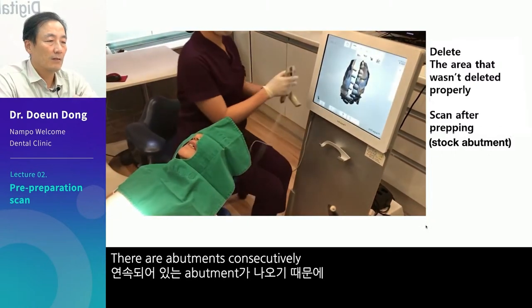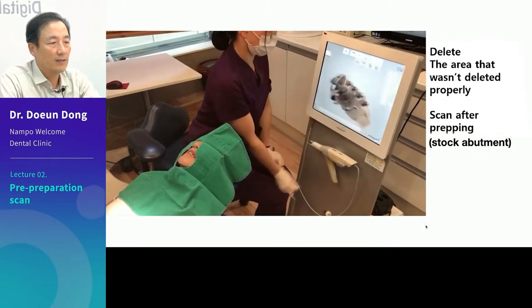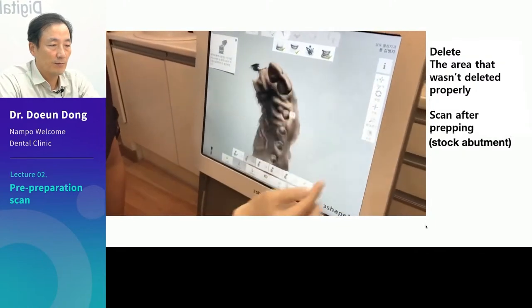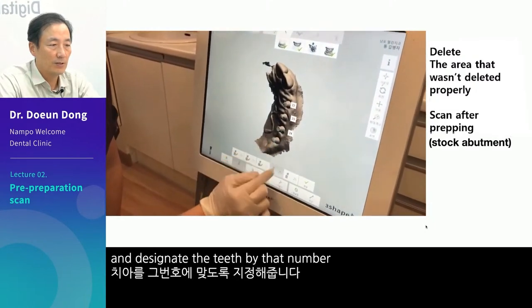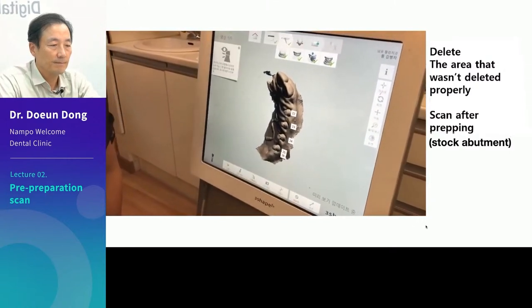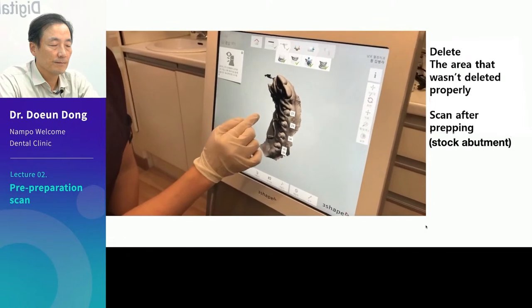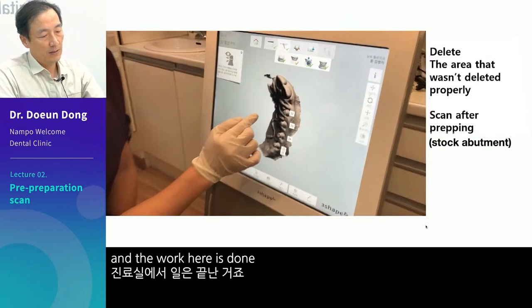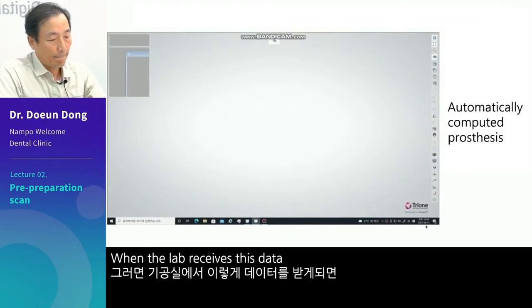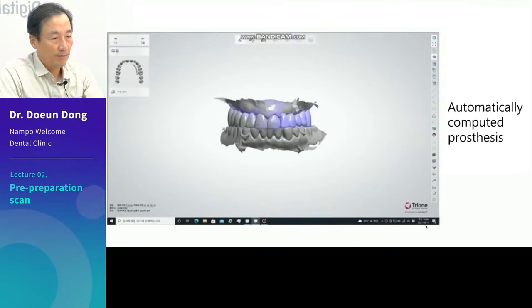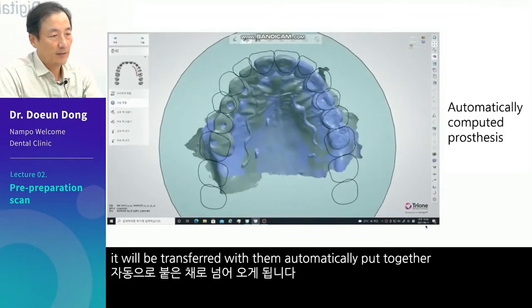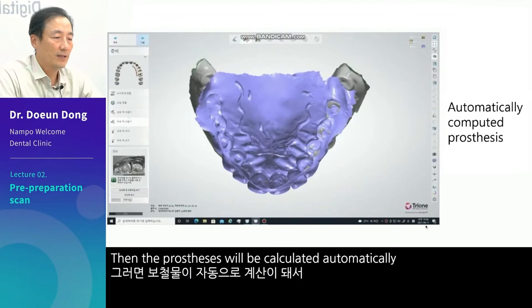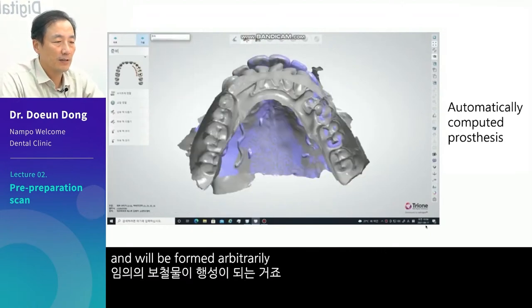There are abutments consecutively. If there are natural teeth in the middle, it will align better. Check the bite and designate the teeth by number. Send this data to the lab — the work here is done. When the lab receives this data, it will be transferred with them automatically put together. Then the prostheses will be calculated automatically and will be formed arbitrarily.